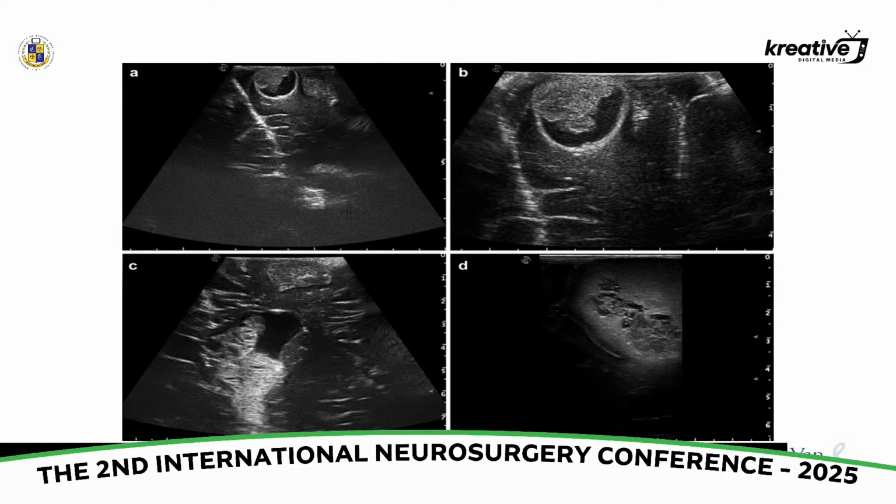This is our OR setup in Colorado. There are specific neurosurgical probes, but really any probe can work. What's the difference with a neurosurgical probe? They're smaller because our craniotomies are smaller than, say, an abdomen.